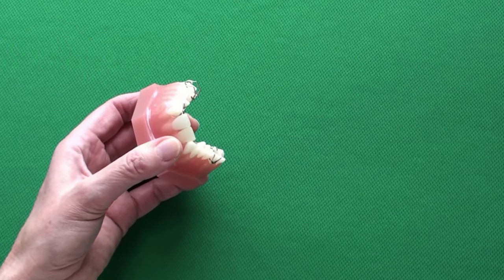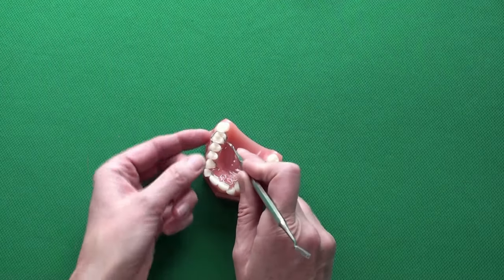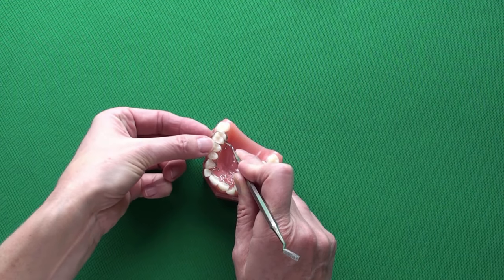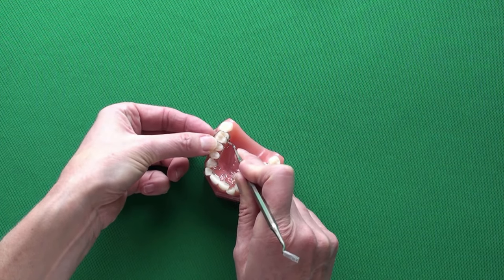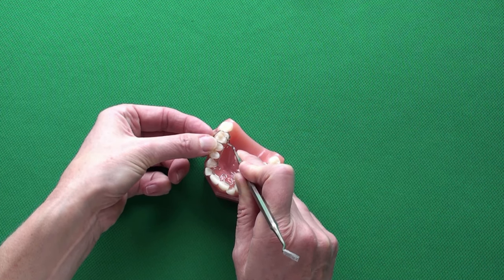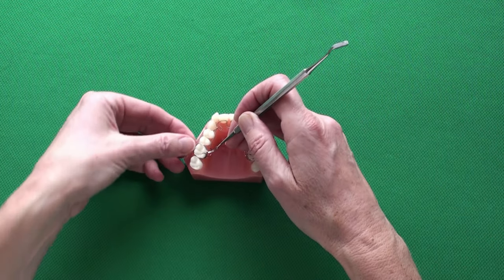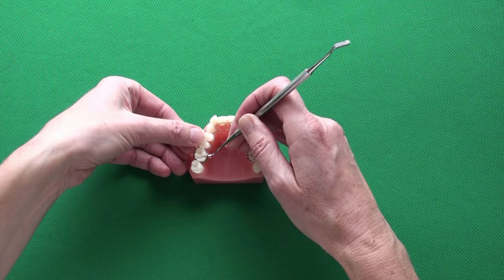Don't pull it away from the tooth too much because this can distort the body wire. When resin ledges are in place you might have to use an instrument placed apical of the crib wire and your finger on the buccal side. With these two purchase points, loosen one crib at a time.